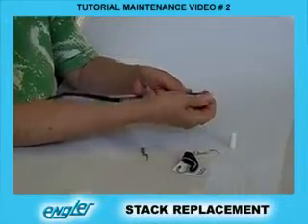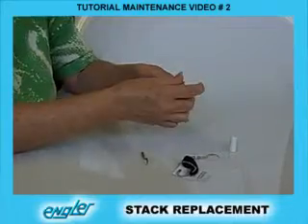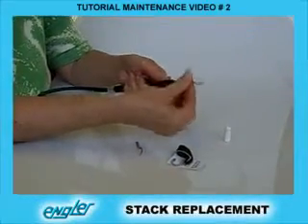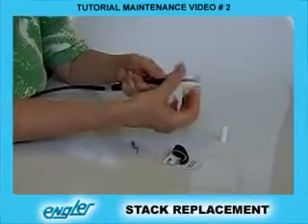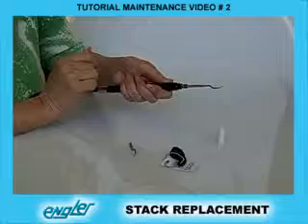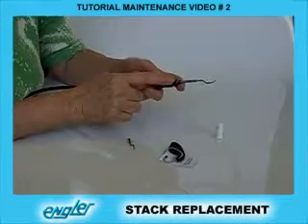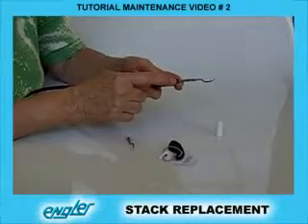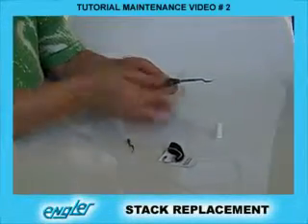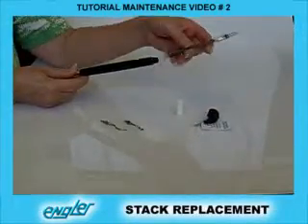If the stack is stuck and will not come out, take a tip, screw it on, give it a few turns and then pull straight out. If it is still too difficult to remove, put a little bit of Vaseline or mineral oil on the O-rings and it will slide in and out much easier.